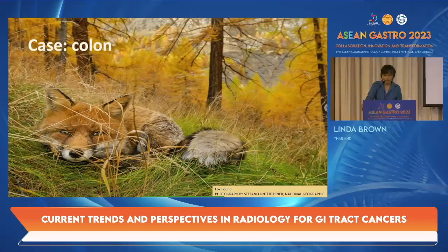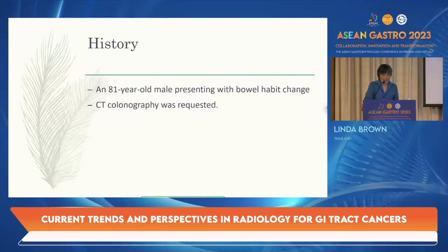Okay, let's move on to colon. This is a gentleman, 81 years old, presenting with bowel habit change. And at that time, CT colonography was requested. I think you should have scoped it, right? But whenever the patient is a little bit too old or too frail, you offer to me, which I'm thankful for because I could have a case to look at.